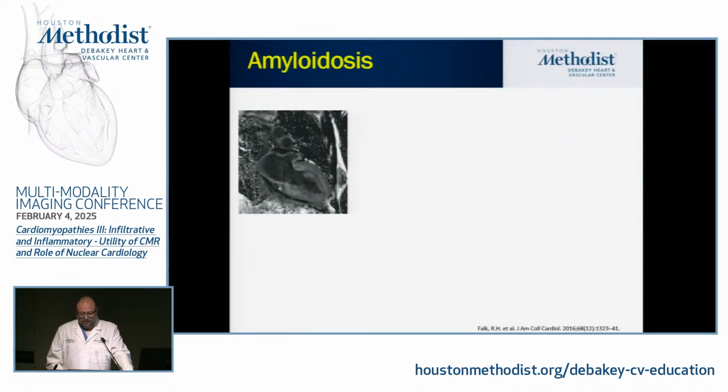It wasn't until people realized that when you get an MRI like this, and some of the cases that Dr. Shah showed earlier, this is most likely amyloidosis, but this can be either AL amyloidosis or ATTR amyloidosis, which used to be called senile amyloidosis.